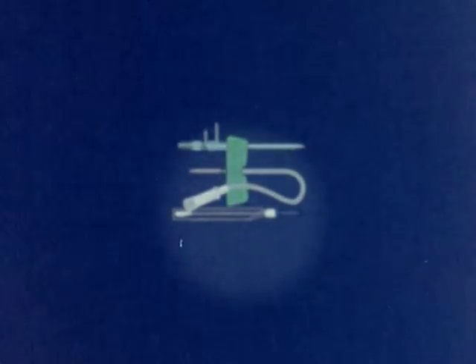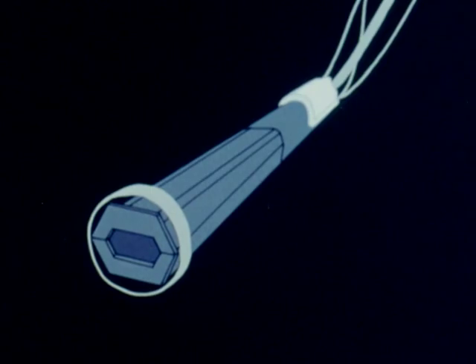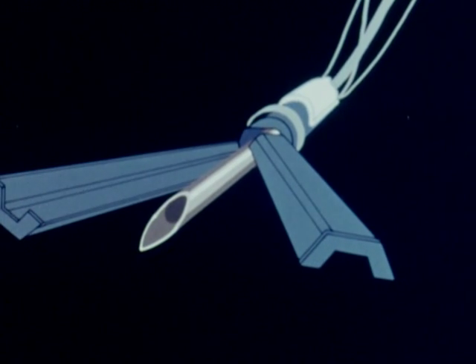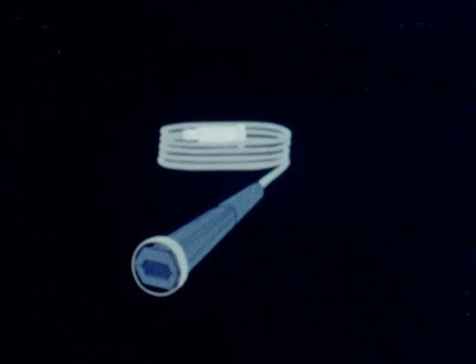The third venipuncture device is the catheter, which is sometimes used for entering the veins of the antecubital fossa when the veins of the forearm are not practicable, for cut-down procedures, for long-term parenteral nutrition, and for such specialist techniques as central venous pressure monitoring. The long catheter is inserted into the vein in the usual manner, and then threaded along as far as required. This process could be time-consuming, and has now been simplified by the recent development of the drum cartridge catheter.